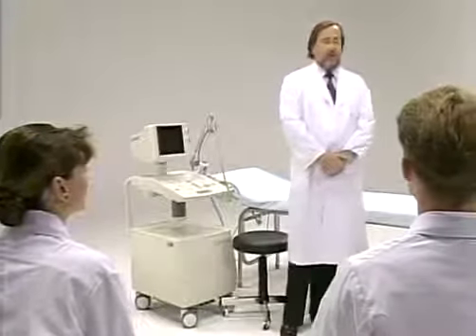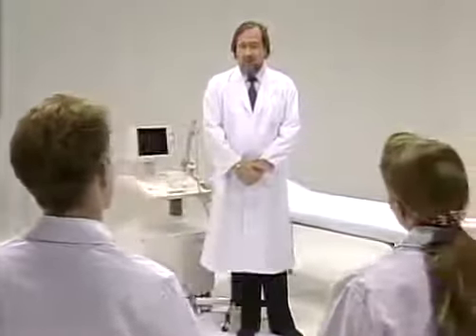Ultrasonography is characterized by the real-time imaging of planes within living soft tissue, which could not be visualized previously. Ultrasonography is painless, non-invasive, and cost-effective. Thanks to these advantages, ultrasonography has become the preferred modality for a wide range of abdominal screening examinations.